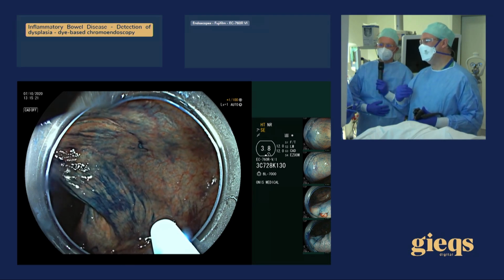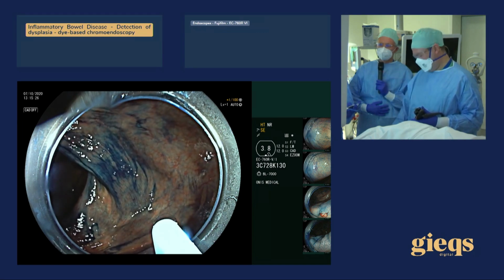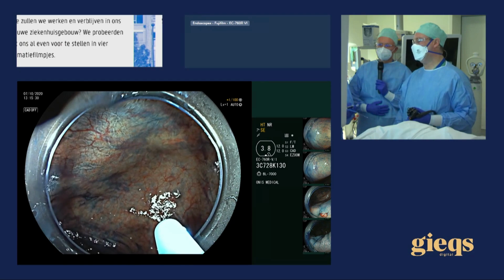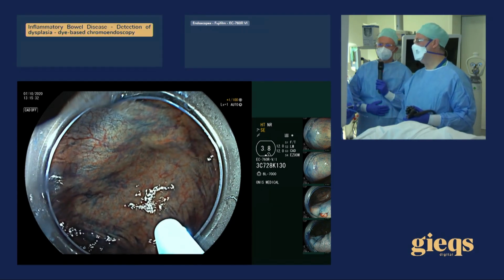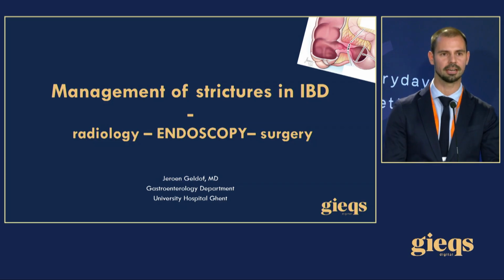That's really crucial. And then once you know what these lesions look like and you have shown a good adequacy in neoplasia detection rate, then you can move forward with the virtual chromoendoscopy, and that's basically it. Anybody can learn this. Of course, I'd like to stress that.